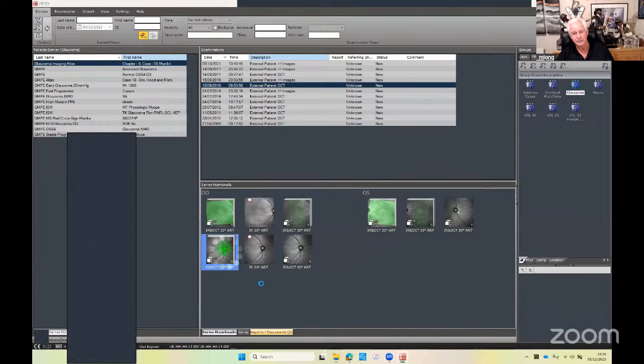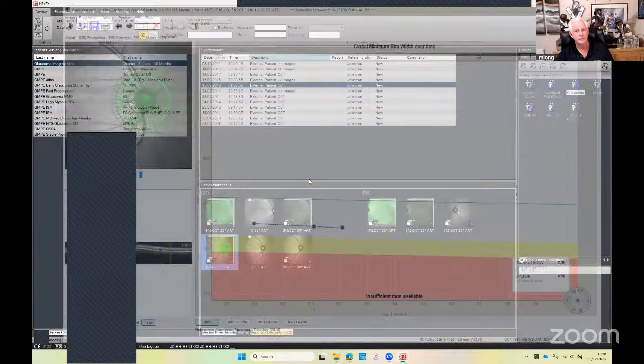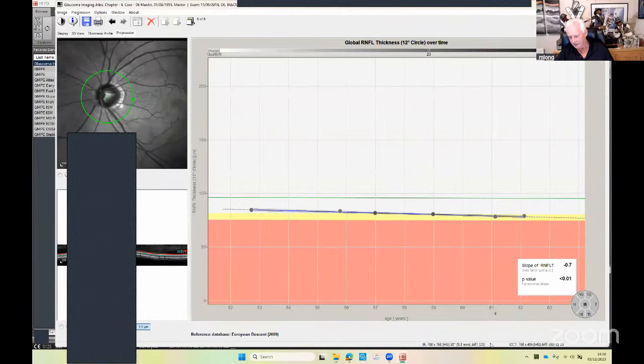Let's see what we've got here. Different exam, a different quality. No, this one's a lower one, 22. So that didn't help. What did we start with? 23. So this patient already was quite low quality anyway, but maybe that's the best they could get from him.